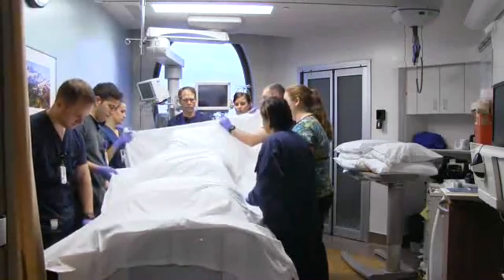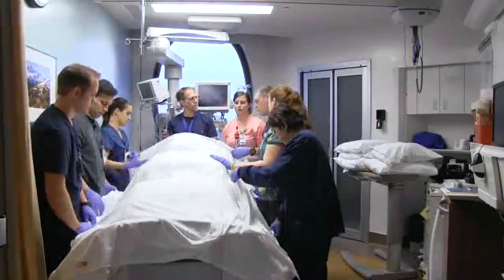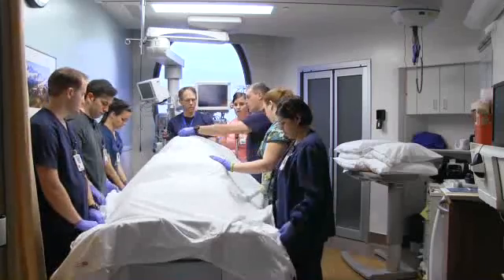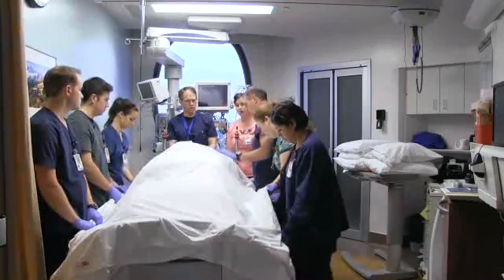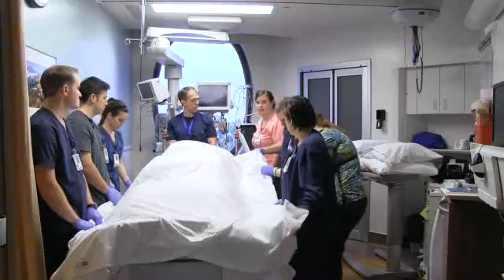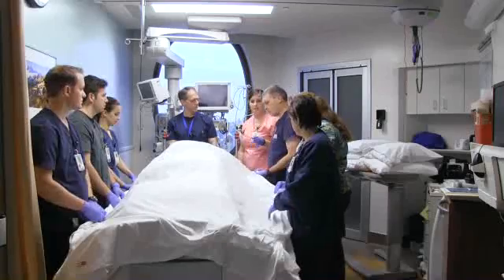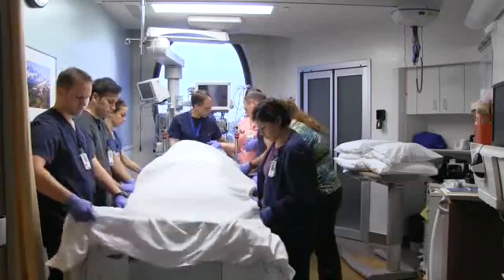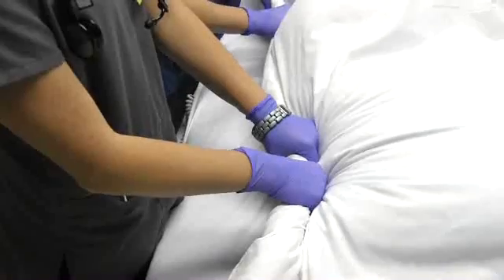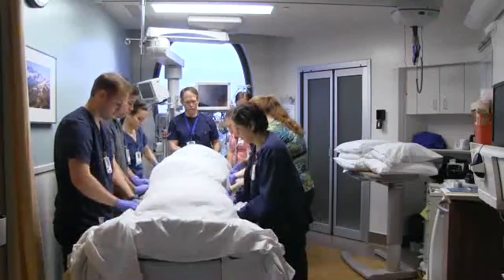Communication becomes key at this point. Make sure that your point person is the only person talking. Once those sheets are in place, you're going to take all three sheets and roll them together. You're going to be turning towards the ventilator — the people on the ventilator side roll their sheet down and under, and the people on the far side roll all three sheets together upward. Get them as snug as possible to make a nice human burrito.